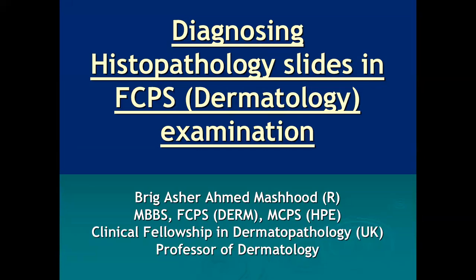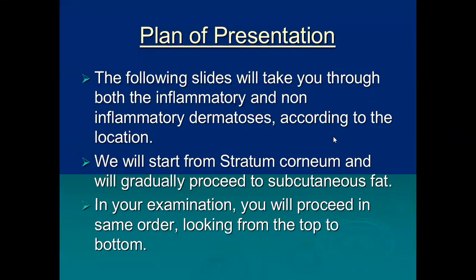This lecture is made specially for the FCPS residents who are appearing in their exit dermatology examination. The plan of my presentation will be to take you through both inflammatory and non-inflammatory dermatoses according to their location.